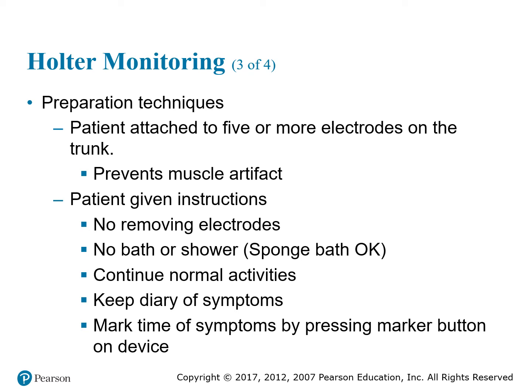And the skin is prepped prior to attaching the electrode, sorry. Skin prep usually involves cleaning it off with an alcohol prep. Make sure they don't have any sweat or lotion so the electrodes can stick for a long period of time, because remember, they're wearing this anywhere from 24 hours to 48 hours. So we've got to make sure those electrodes stay on really well.